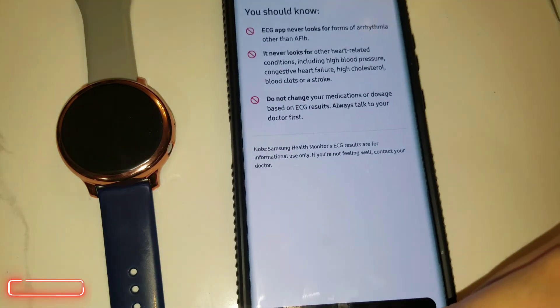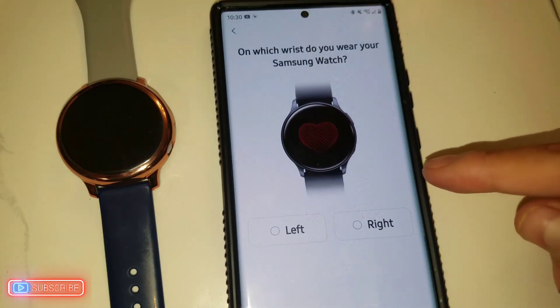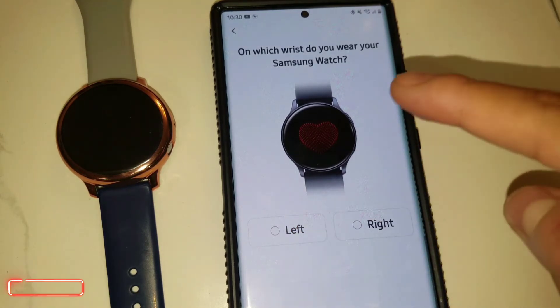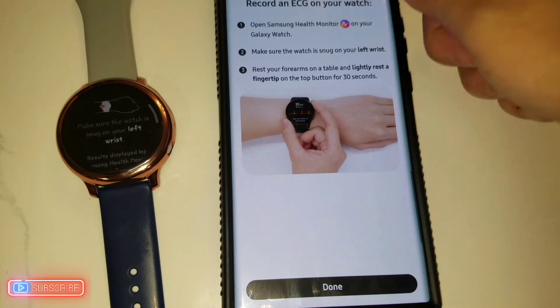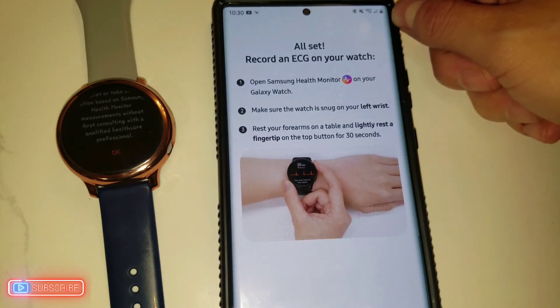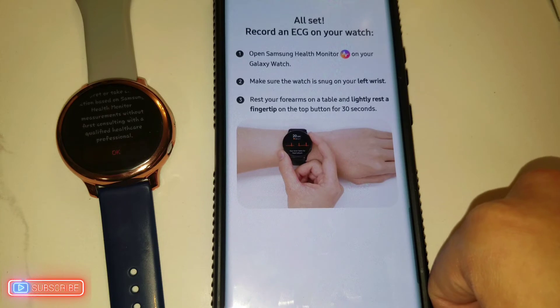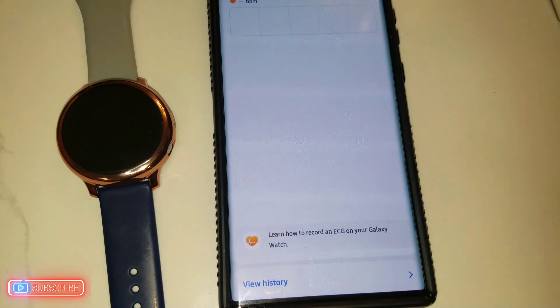If you want to be 100% accurate, make sure you visit your doctor and follow their advice. Next, it asks which wrist you wear your Samsung watch on — in my case I use the left, but you can select right if applicable. It then says: all set — open Samsung Health Monitor on your Galaxy Watch, make sure your watch is snug on your wrist, rest your forearms on a table, and slightly rest a fingertip on the top button for 30 seconds.